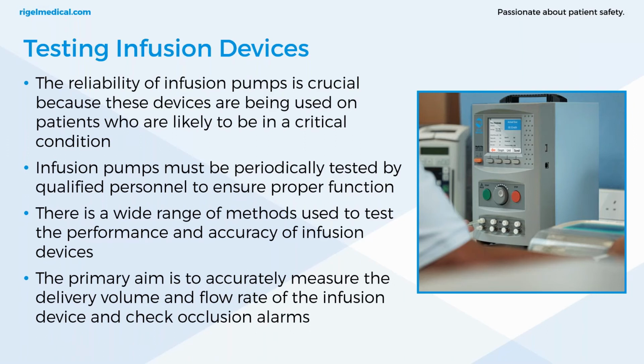So, yeah, it's just really for ensuring that the infusion is reliably delivering what it's stating. So it's prescribed dosage, its volume, and also that pressure that overcomes any intermittent resistance. But while doing all of those things, ensuring that there's no harm being caused to the patient.